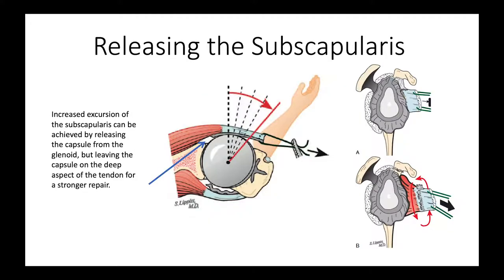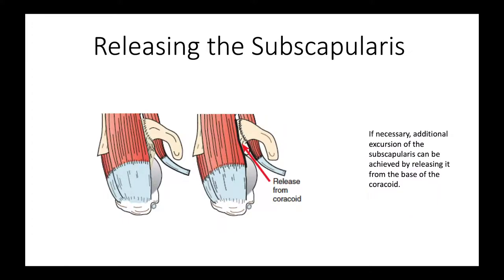Often the subscapularis is contracted, so we need to do some releasing of it at the time of surgery to get increased excursion. One of the releases we do is release the capsule from the glenoid, as shown here, which enables us to gain increased external rotation. We can also do a 360-degree release around the tendon, freeing it up from the capsule and other soft tissues. If we need further mobility, we can release it from the coracoid by making an incision, as shown here.